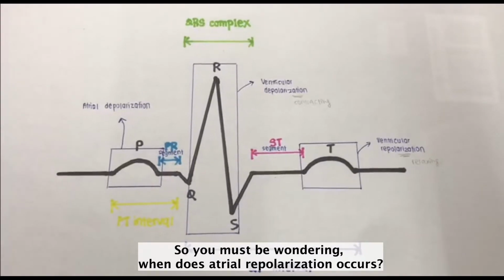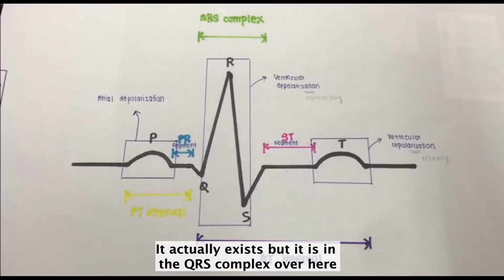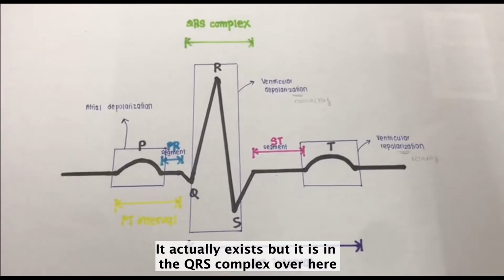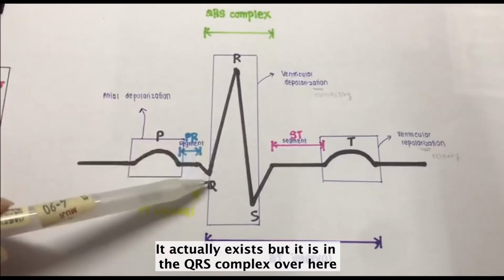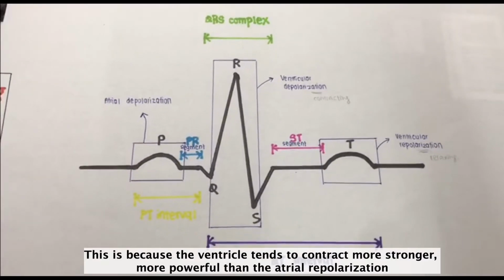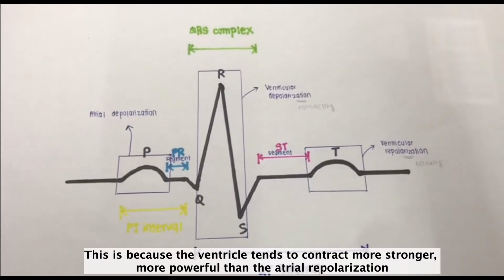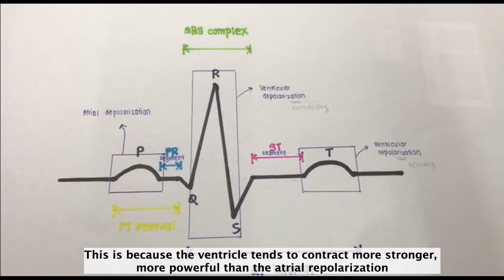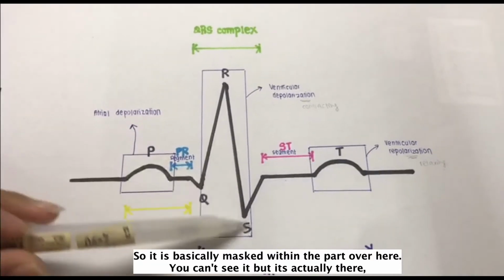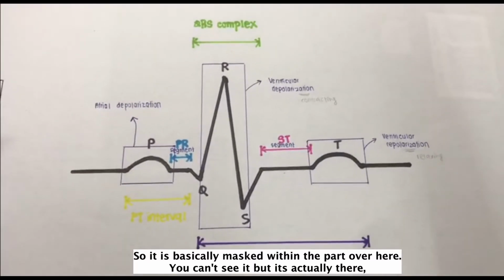So you must be wondering, where is the atrial repolarization? It actually exists, but it is in the QRS complex over here. This is because the ventricle tends to contract more strongly, more powerfully than the atrium repolarization. So it is masked within this part over here. You can't see it, but it's actually there.